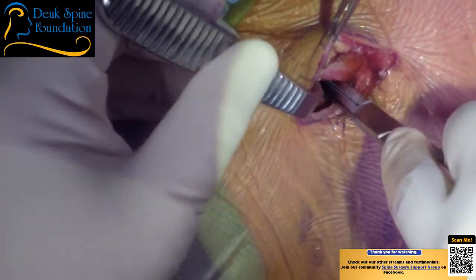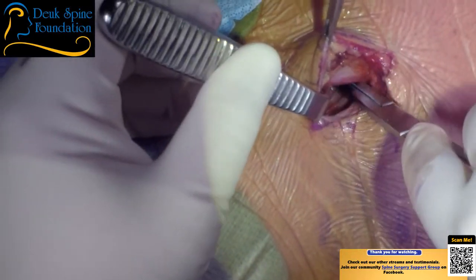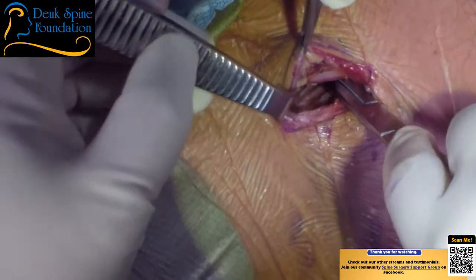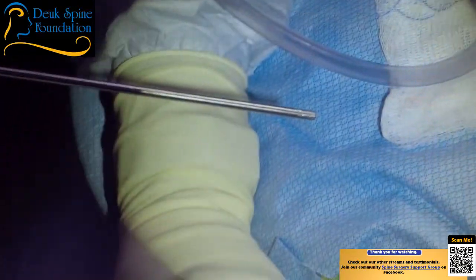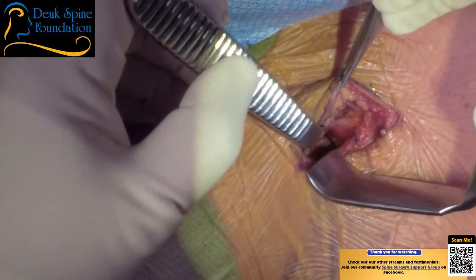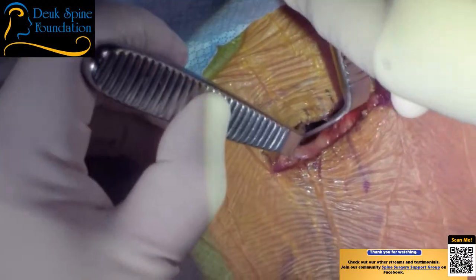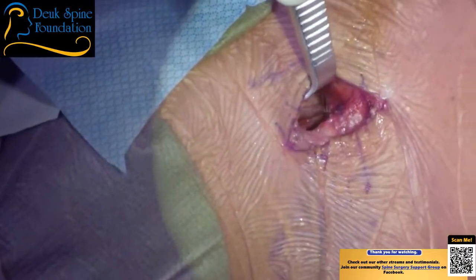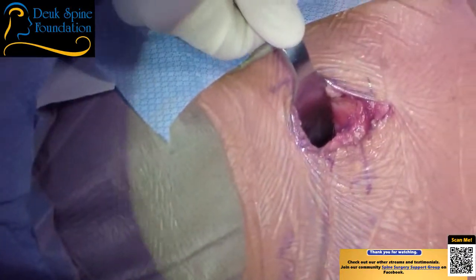This may be the deepest neck I've ever done. I'm really glad we changed the incision. I wouldn't have been able to do this with a transverse incision. Let me have a lip. So I'm down on the spine, and it's literally the deepest I've ever seen. Your hand is in the way. So yeah, this would have been impossible to do.